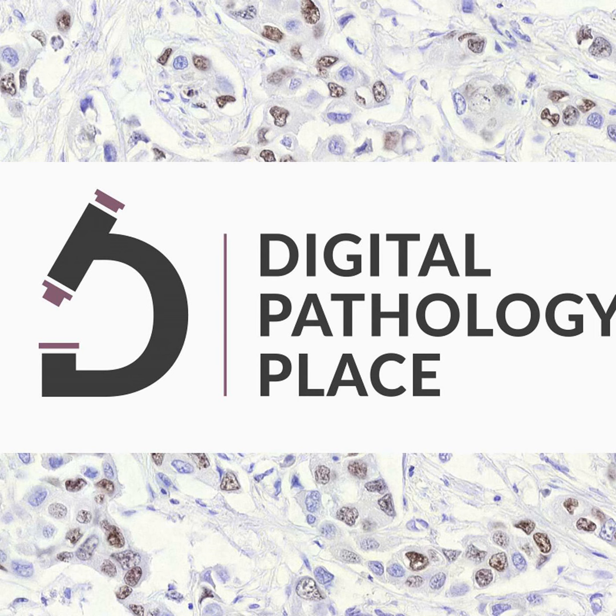What is an H-score? It's a score where you say, okay, how much of this tumor is affected with how strong an expression of a marker. I think 300 is the maximum score. Anyway, there is a way of calculating this. This is a classical way of evaluating immunohistochemistry, how much of the marker is there.